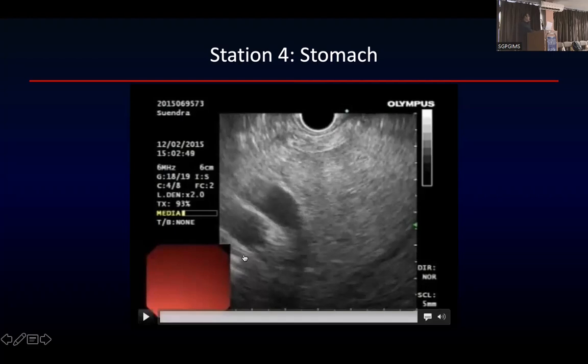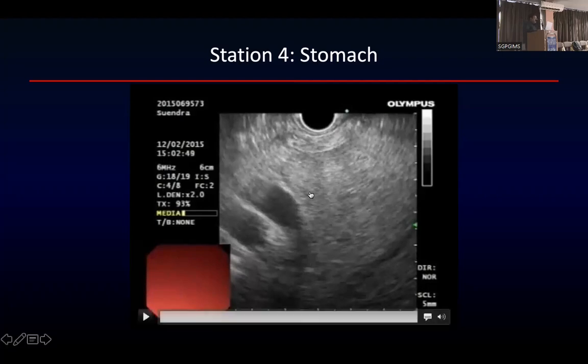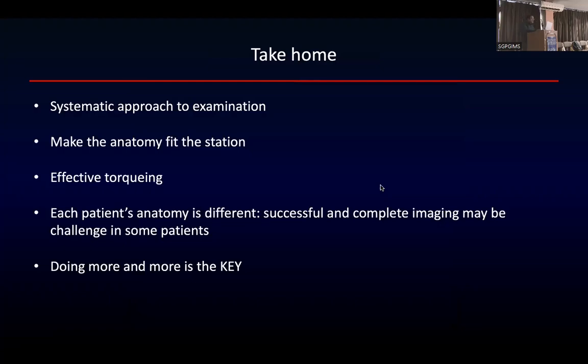What will come just below the portal vein? At the liver hilum, the CBD. Okay, so you can very well visualize the CBD from the hilum. So this is your portal vein, this is your bile duct, this is your hilum of the liver. Okay, so again, systematic approach to examination is a must. Make the anatomy fit the station. Effective torquing. Each patient's anatomy is different. Successful and complete imaging may be challenged in some patients. Doing more and more is the key.